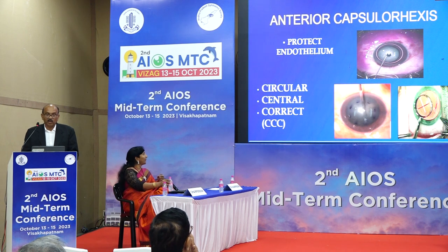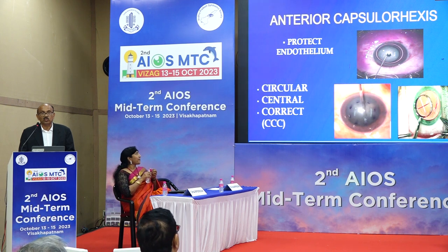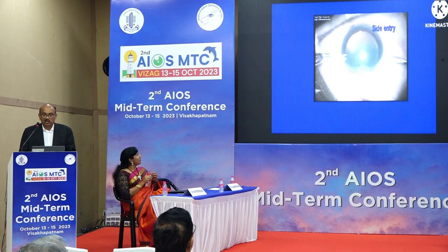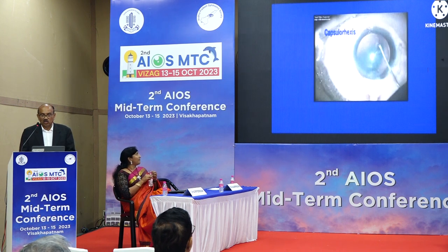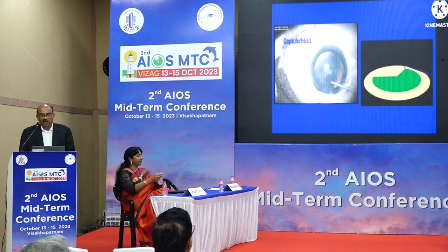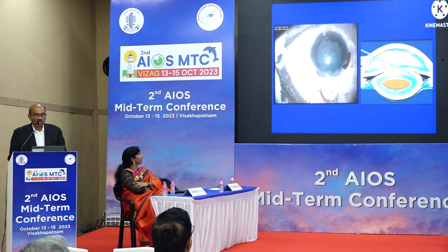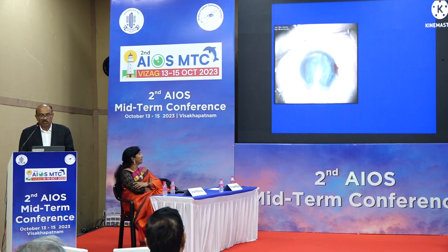In the anterior capsular rhexis, you want a central circular rhexis, which is made with a rhexis marker. 5 mm rhexis markers are available, with which you can make a correct rhexis. This is my old video from the 90s. I prepared the rhexis, and afterwards the hydro procedures: hydrodissection, hydrodelineation, prolapse of the nucleus, and expression or delivery of the nucleus with visco.